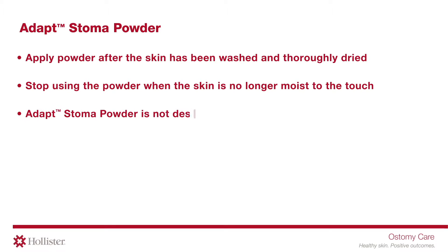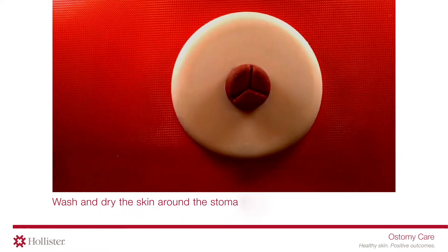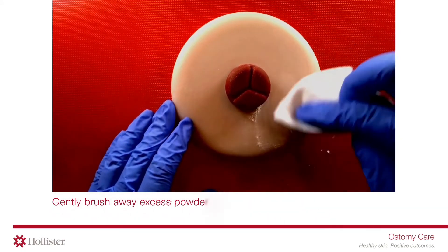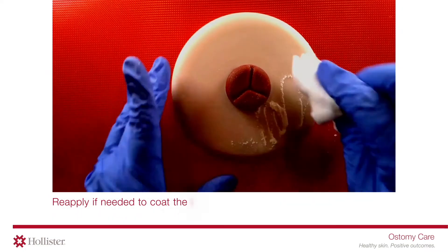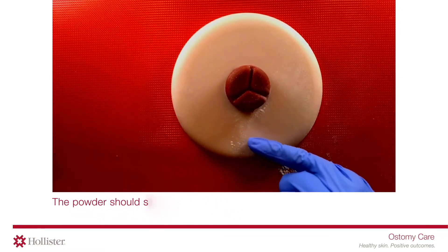Adapt Stoma Powder is not designed to be used for the prevention of skin irritation. Wash and dry the skin around the stoma thoroughly. Apply a small amount of stoma powder to the irritated skin area, then gently brush away excess powder using your hand or a soft tissue. Reapply if needed to coat the irritated area.